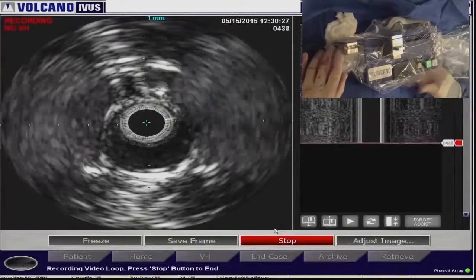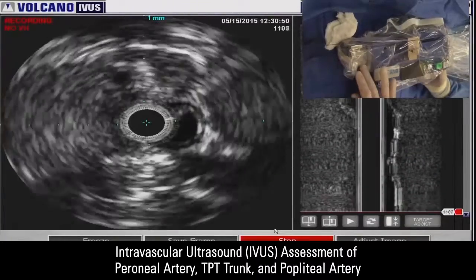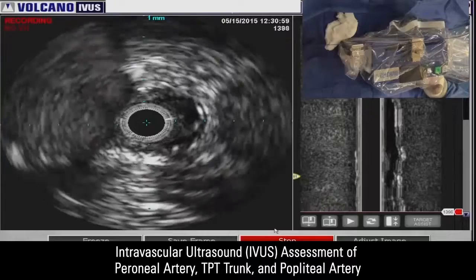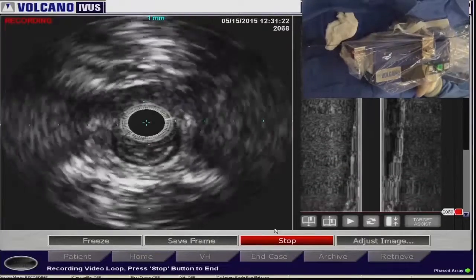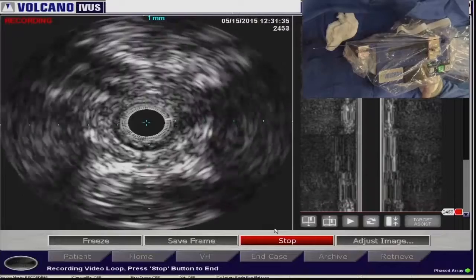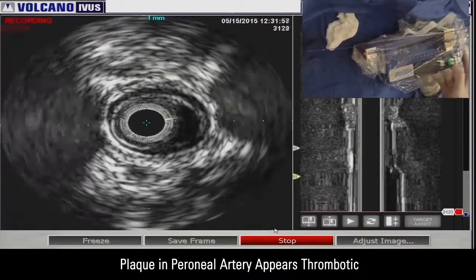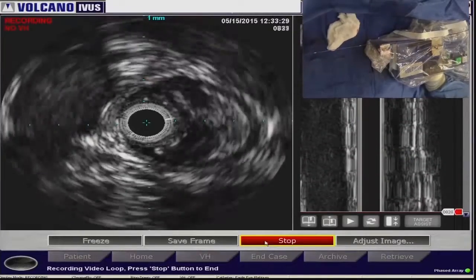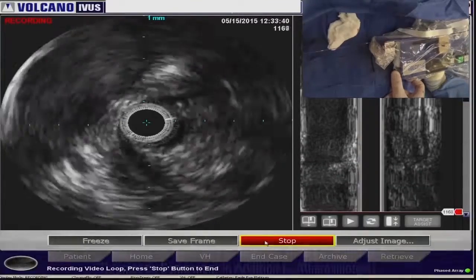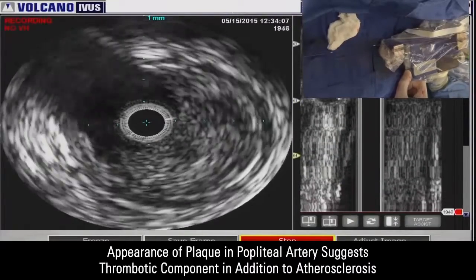This was a 5 mm filter deployed in the distal peroneal artery. The next picture shows an IVUS assessment of the peroneal artery, TPT trunk, and popliteal artery. This is an automatic withdrawal of the IVUS catheter, essentially looking at plaque appearance and morphology as we withdraw the catheter. Within the peroneal artery, you see this hypoechogenic appearance of the plaque that appears to be thrombotic in nature. This is the peroneal artery joining with the posterior tibial artery. Now we're getting into the P2-P3 segment of the popliteal artery, and you can see the thrombotic or hypoechogenic appearance of the plaque, suggesting a thrombotic component on top of an atherosclerotic process.